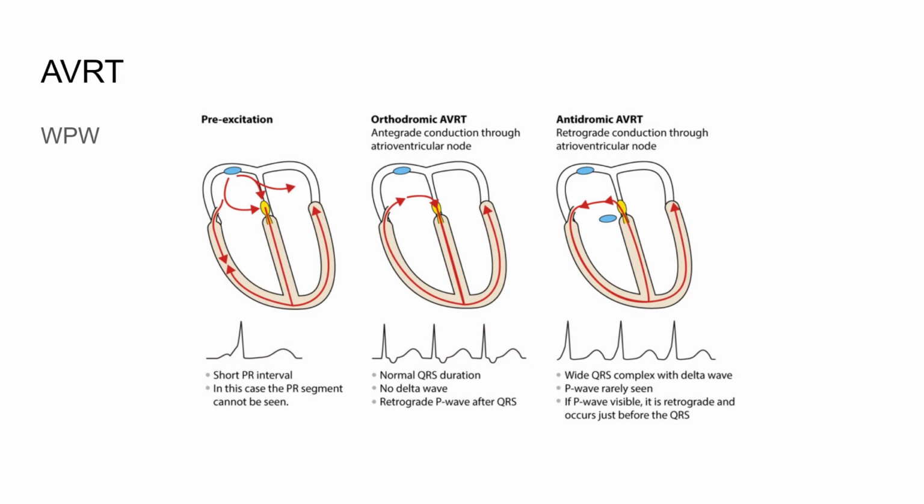Impulses originating in the ventricles are going to cause a wide presentation of the QRS. Ventricular rhythms are typically wide. So if this impulse is reaching the ventricles at the same time as it's reaching the AV node, it's going to cause the QRS to widen out and the PRI to shorten, right?